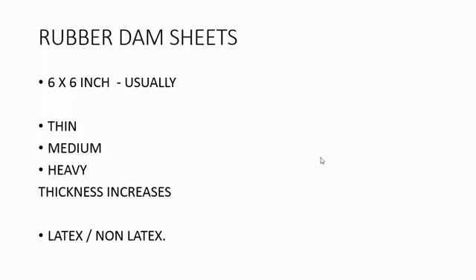तो ऑन एन एवरेज सिर्फ एक पैकेट लिया आपने तो मीडियम ले लो, बहुत सारे पैकेट्स ले रहे हो तो एक ऐड ऑन हेवी ले सकते हैं. ठीक है. एंड लेटेक्स नॉन लेटेक्स दोनों अवेलेबल है. लेटेक्स इजीली अवेलेबल है, तो व्हाटएवर इट्स अकॉर्डिंग टू योर डीलर एंड डिस्ट्रीब्यूटर यू कैन आस्क फ्रॉम देम.